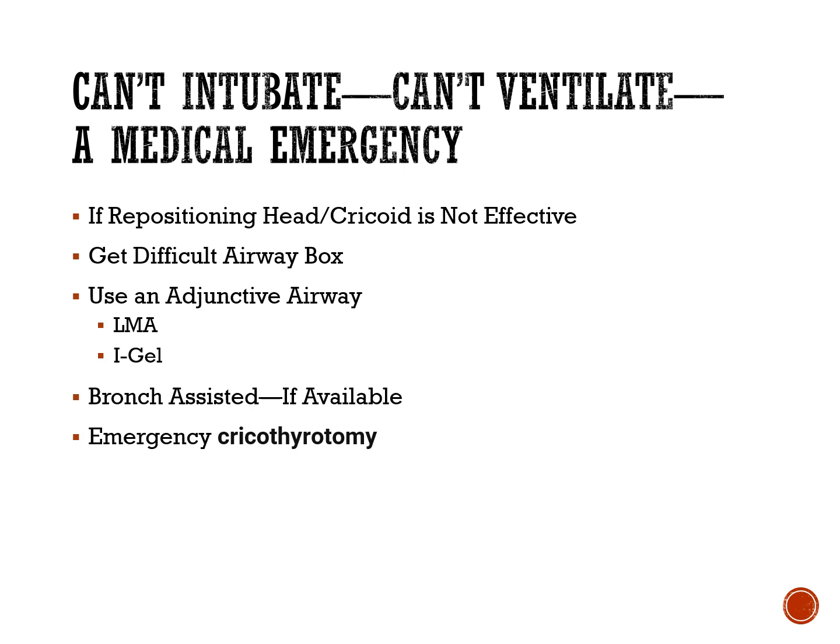That is indeed a medical emergency. This slide is speaking to it. If you're the one intubating, so you're the RT intubating, or the nurse assisting the intubator, you should immediately call anesthesia. It may take them a little while to get there. In the meantime, you reposition the head and try cricoid pressure.